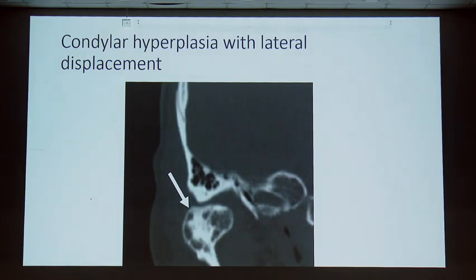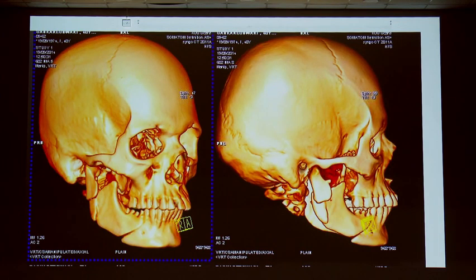Condylar hyperplasia can also occur; whenever the condyle is hyperplastic, lateral displacements are quite common. Regarding trauma to the TM joint: it may be low condylar fractures or high condylar fractures. High condylar fractures are very important because they lead to disc derangement.